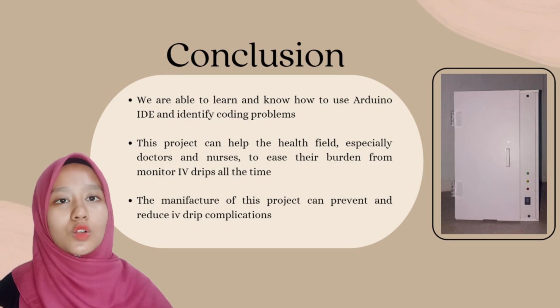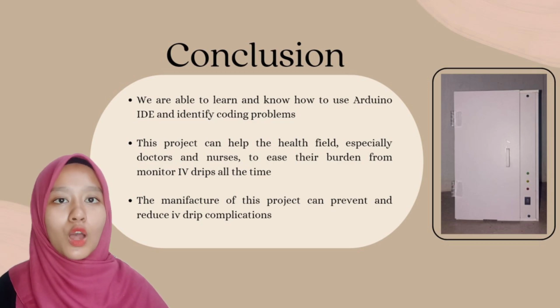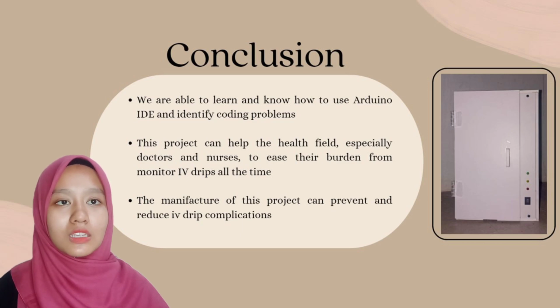So on, we also can learn and share opinions about casing with people who are more experienced, to come up with various ideas for making casing before getting an ideal casing for use in hospital to make it easier for users such as nurses and doctors.